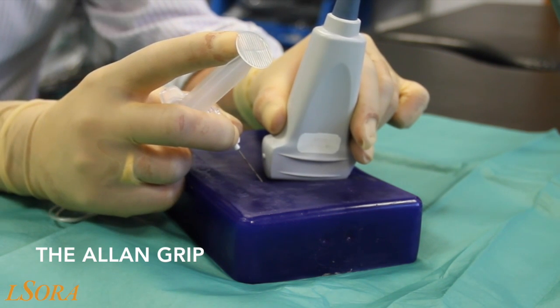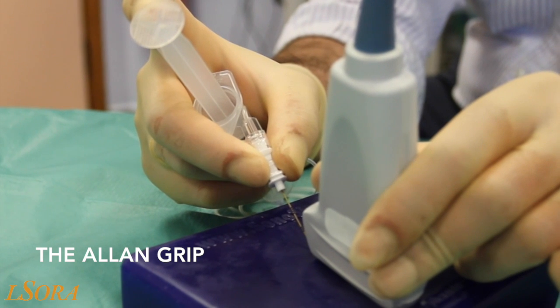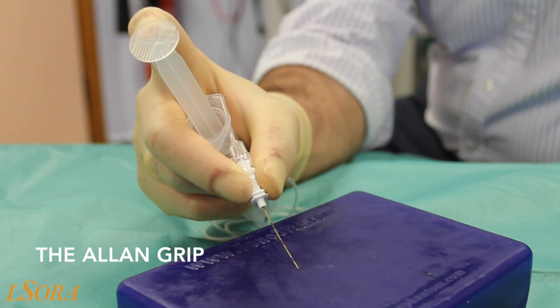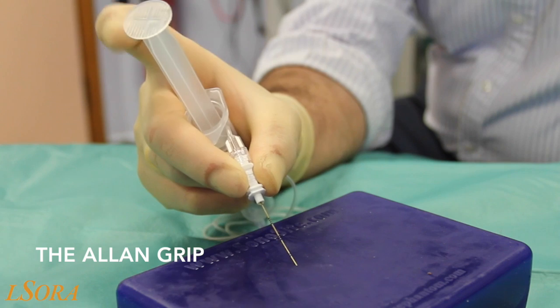The needle is inserted with the probe in situ in the normal manner. The probe will now be removed for clarity. You can see that aspiration and injection is possible with this technique, as is fine needle control with that pincer grip.